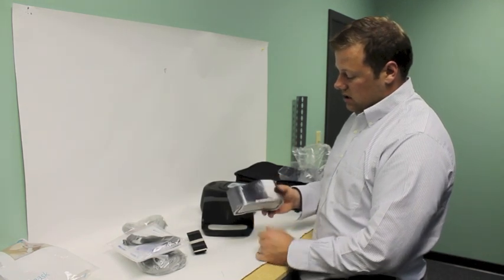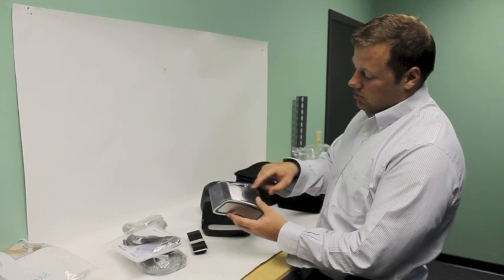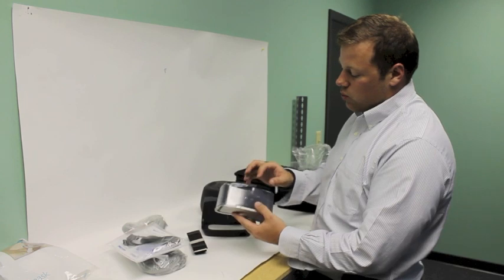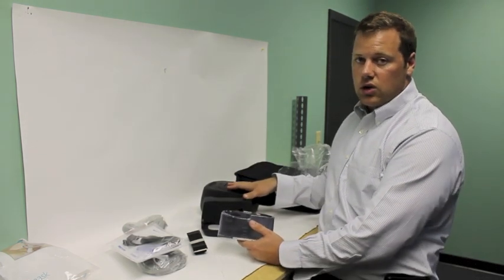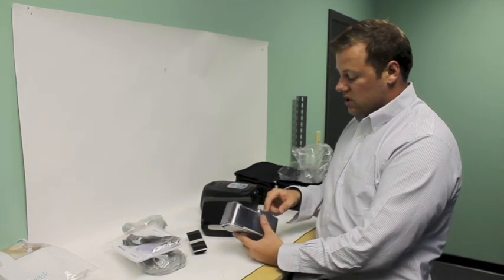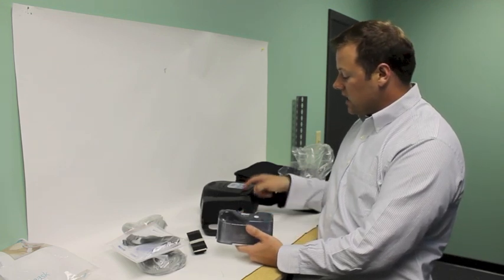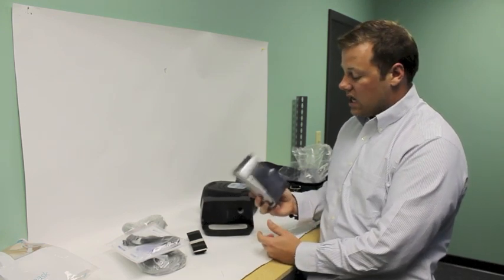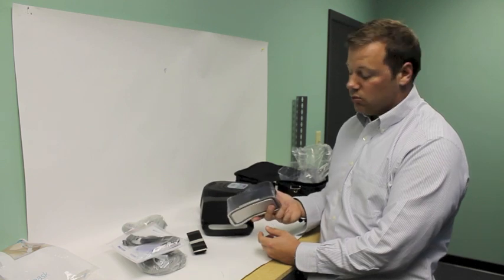Now, what's nice about this water chamber is that, you can't really see it too well, but it has enough compartments in here that if you ever left a little bit of water, a little bit of moisture, and you throw this whole thing in a bag and start traveling with it sloshing around, it has quite a bit of little compartments that the water would have a hard time getting back into the machine, shorting it out. But nevertheless, we always recommend that you take the water out of the water chamber when you're traveling or moving it.